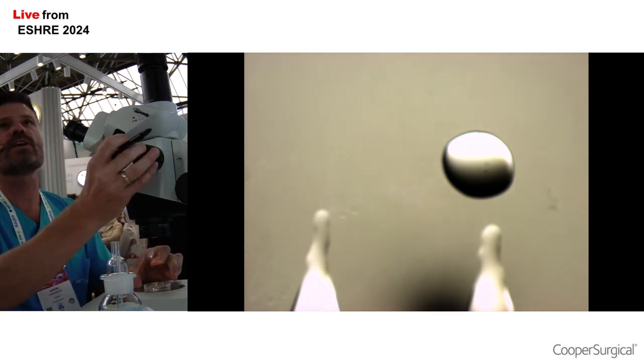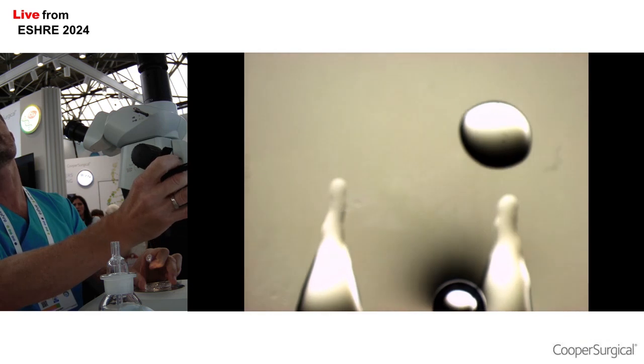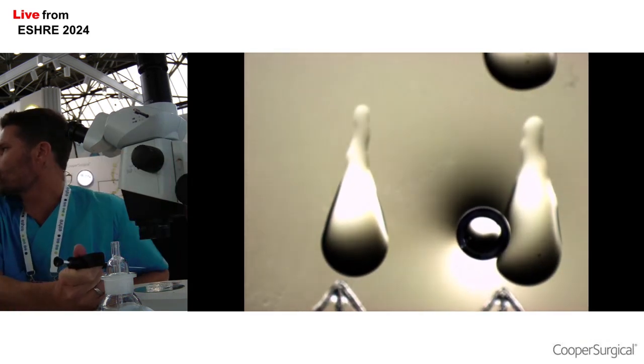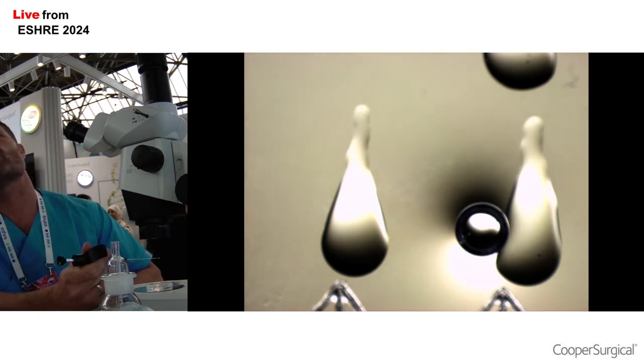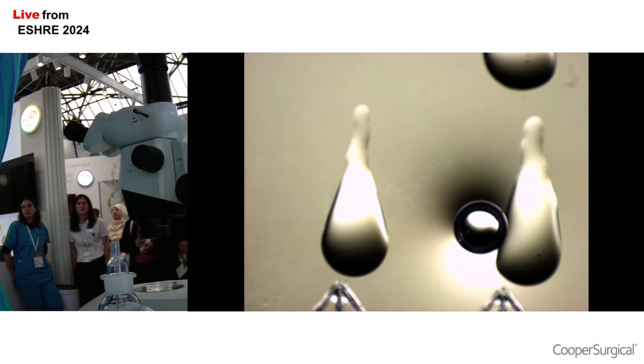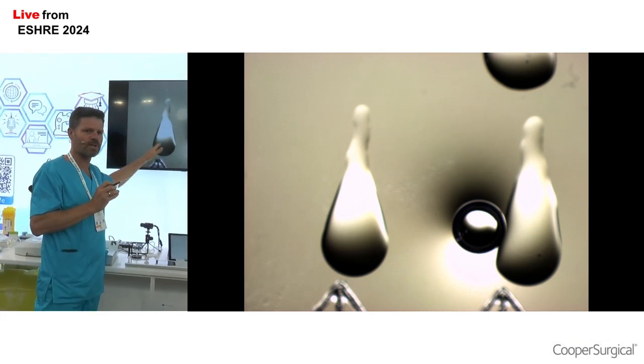And what I'm going to do is in each of these drops that I've prepared, I'm going to place a small amount of the sperm preparation. The reason why I've made this tear-shaped drop is because I'm going to place the sperm at this end of the drop so the motile sperm will go swimming down and then arrive at this area where the hyaluronic acid is. So that will hopefully clean up our sample and we'll get more motile sperm in this area where we're going to select the sperm.